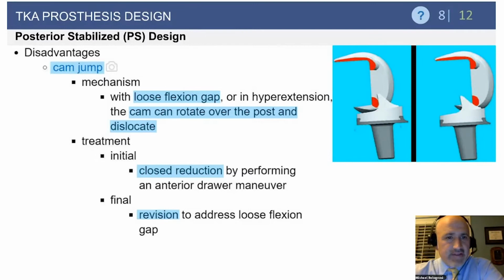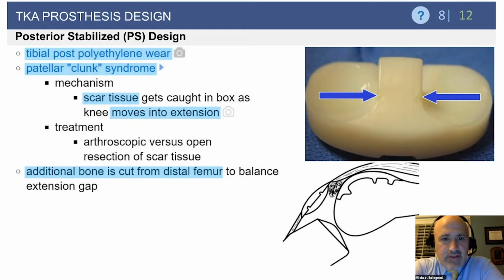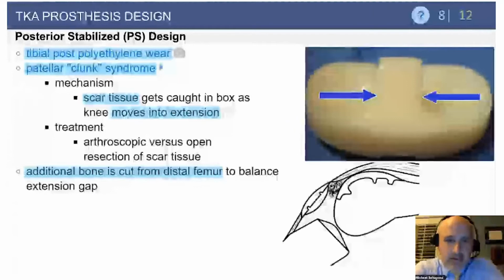Here are the disadvantages. You've got to remember about cam jump, risk of that femur coming over the post if the flexion gap is too loose, or certainly in hyperextension, that can occur as well, depending on what's going on with the extension gap. Closed reduction is going to be your first round of treatment. Certainly if you have recurrence or there's an issue with still perceived instability, that's going to potentially lead to a revision. So it has to be considered with these prostheses.